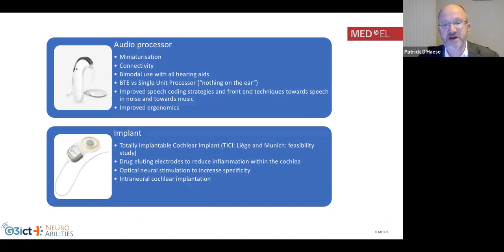Now, bigger innovative steps are happening in the field of the implant itself. Recently, the company I work for implanted fully implantable cochlear implant systems, so you don't have anything on the outside anymore, in two cities in Europe called Liège and Munich, in the light of a feasibility study. Now, clearly in X years from now, and it's hard to judge when because it depends on a lot of components and parameters, but in a couple of years from now, one can imagine that cochlear implants will be fully implantable. So nothing will be visible anymore.